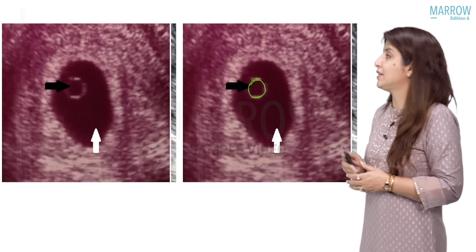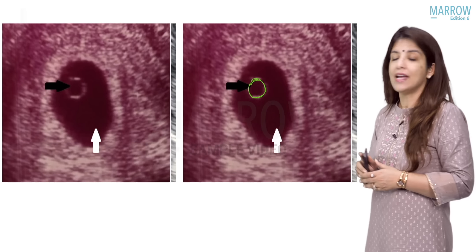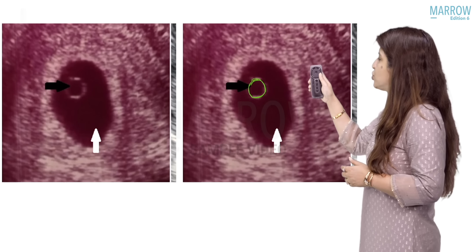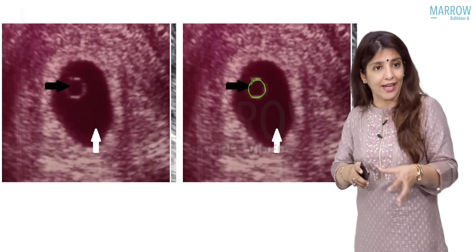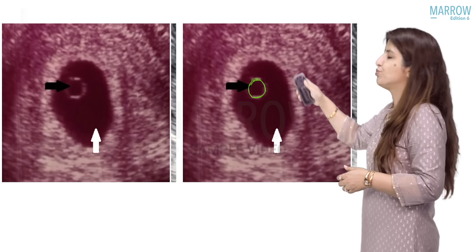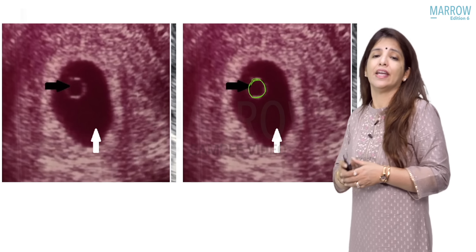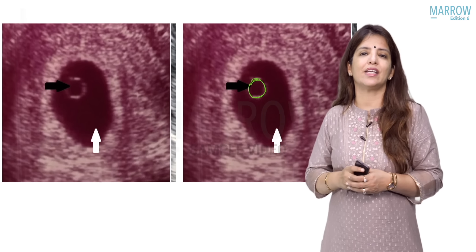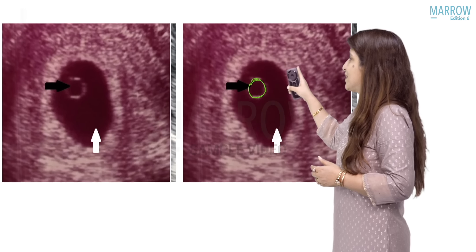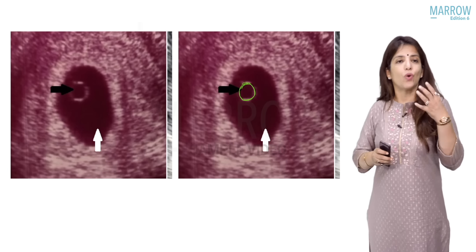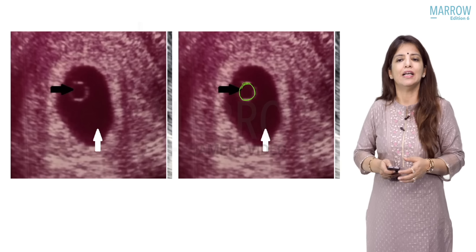In this image, the white color arrow is pointing towards the gestational sac, and the black color arrow is pointing towards a small echogenic circle present inside the gestational sac — that is the yolk sac. In the next image on the right-hand side, the yolk sac is highlighted in green. The yolk sac appears like a bleb inside the gestational sac.